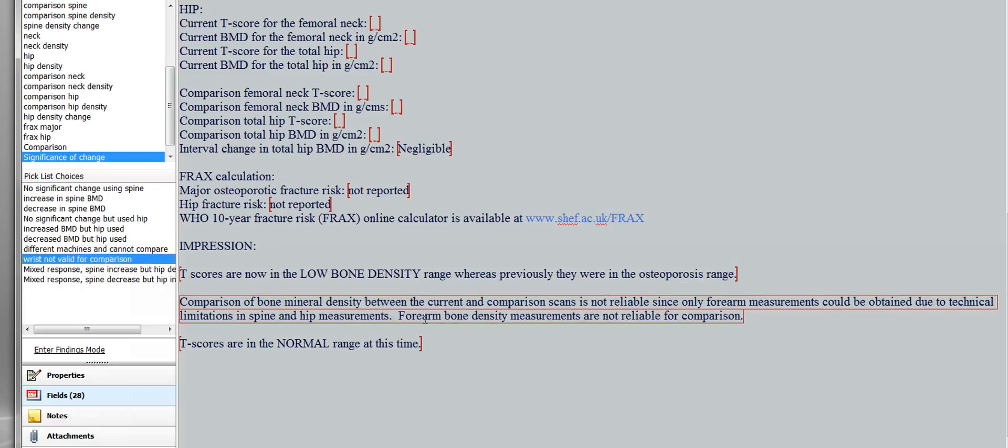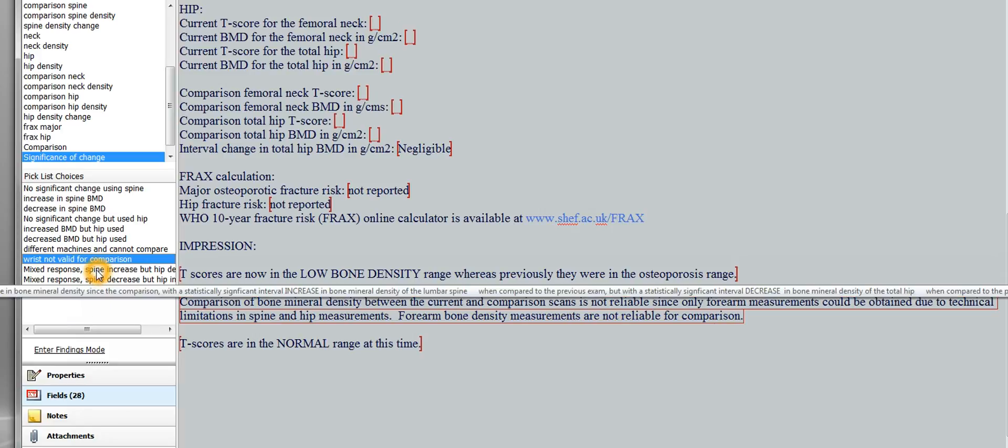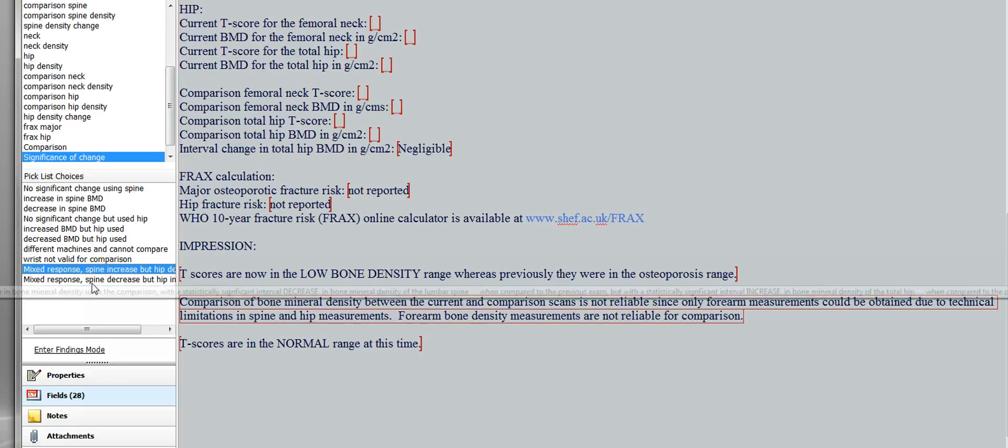Or maybe you had to use a wrist. Well, you can't, you're not supposed to do comparisons of wrists. Say they had bilateral hip prostheses and lumbar hardware or something. You couldn't come up with anything but a wrist measurement. So you could still categorize them, but you can't do a specific comparison. So you would use this. And then, now this is up for discussion. I'm not sure about this, but to use the mixed response, but I have it in here for now and we can discuss it.